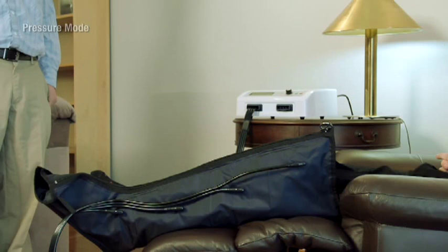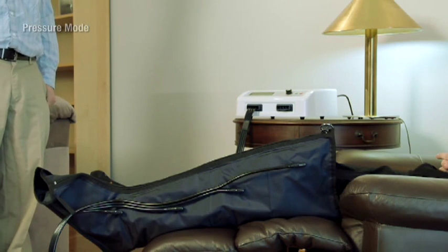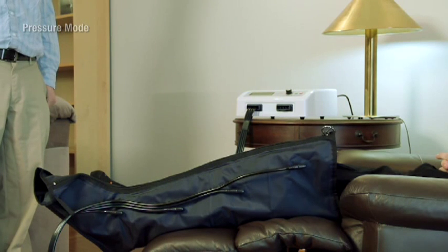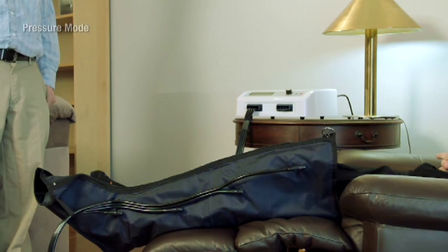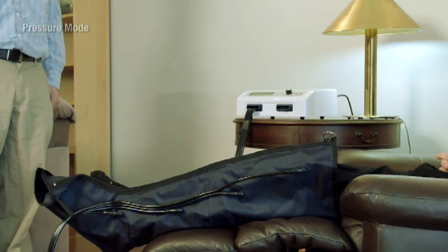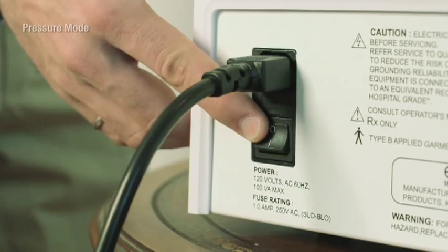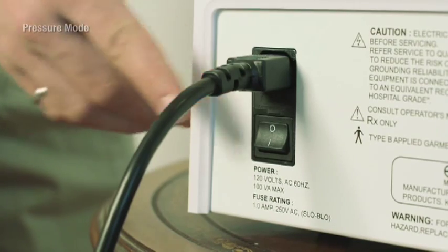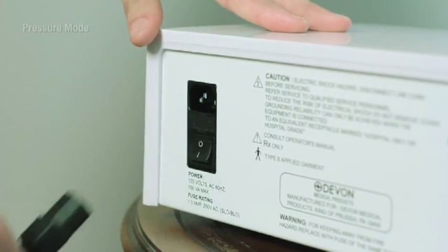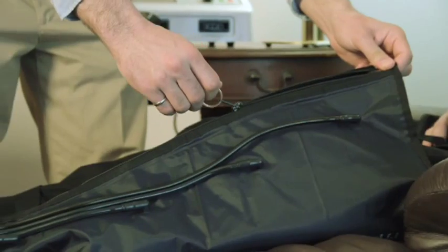After treatment, the device will vacuum air from the sleeve for one minute. The vacuum cycle can go through another one minute cycle by pressing stop. Once the sleeve is deflated, press the power switch found on the backboard to the off position and unplug the power cord. Once the power indicator light is off, it is safe to remove the sleeve.